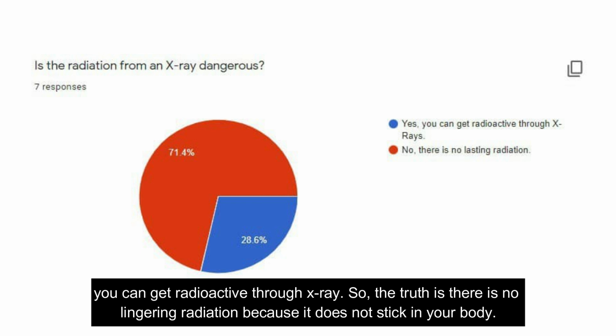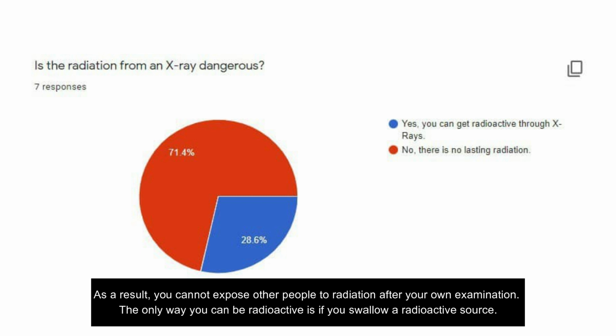So the truth is there is no lingering radiation because the X-rays do not stick around in your body. As a result, you cannot expose other people to radiation after your own examination. The only way you can be radioactive is if you swallow a radiation source.